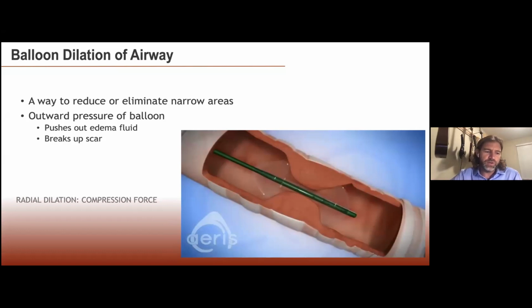And in my first meeting with Dr. Rutter when I was a fellow at Cincinnati, I went into the room and he said, "We need to dilate this patient." And I said, "Well, what did you dilate with last time?" And he said, "Well, we dilated with a 11 balloon or a 10 balloon maybe." And he said, "What should we do this time?" I said, "Well, we're back in the operating room. Let's try a 12." So at that time, Dr. Cotton walked in. I put a 12 balloon in, and this is the first case I did with Dr. Rutter and Cotton. I blew up the balloon, I deflated the balloon, and I realized that I was actually looking into the mediastinum because I'd ruptured the airway. And Dr. Rutter kind of smiled at me, and Dr. Cotton just patted me on the back and said, "Well, this is gonna be a fun 2 years," and walked out. So the balloon is not a risk-free endeavor, but it also did actually help that patient, but that's a completely different story.